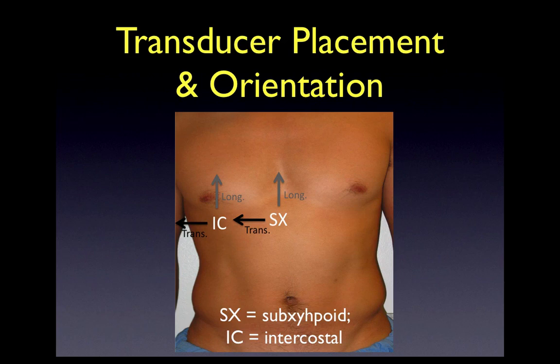The subxiphoid approach can be appealing because, as we talked about in the previous slide, a lot of times when you do IVC studies, we couple it with an echo, and we do often use a subxiphoid approach when performing a point-of-care echo. So it's an area that we're very familiar with. It would also require one less step when you are switching your study from a point-of-care echo to a point-of-care IVC study. You just basically have to change the angle of your transducer.